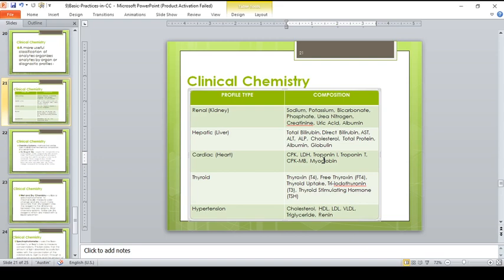Okay, and thyroid test. Dyan yung T4, thyroxine, free thyroxine, thyroid uptake, triiodothyronine or the T3, and the thyroid stimulating hormone. Actually, guys, this is a thyroid test commonly tested in immunology and serology section, but it depends on the classification or on the machine that is used by a laboratory.